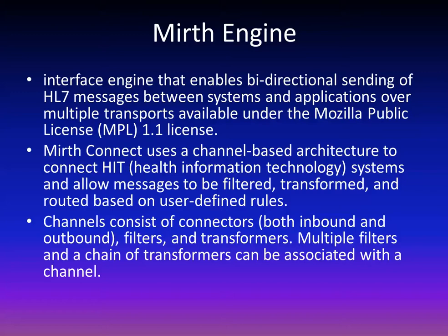That's what Metametrix is still doing to this day. It's a very inefficient way to do it, and it also creates conflict problems with different PAC systems. Generally speaking, they don't like you to do that anymore. They prefer you not put the actual report into the PAC system as a DICOM image.